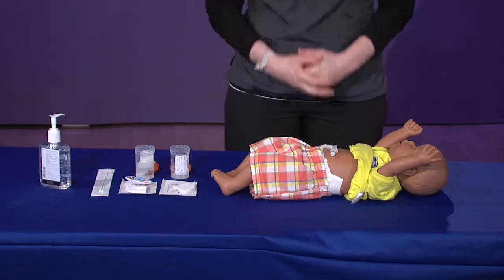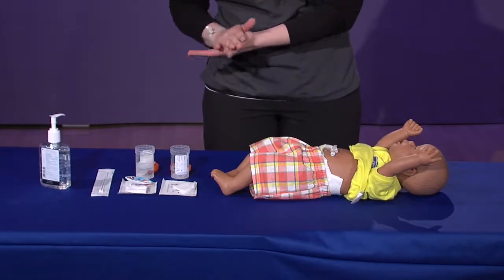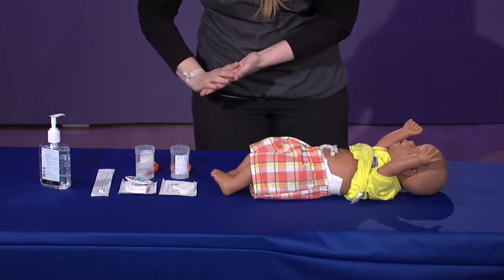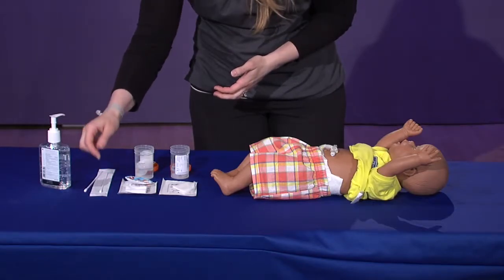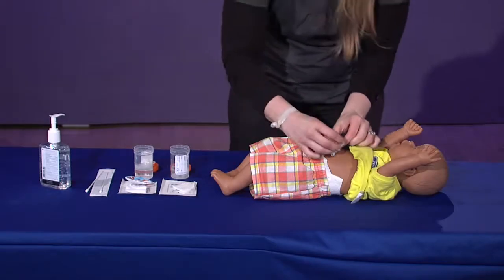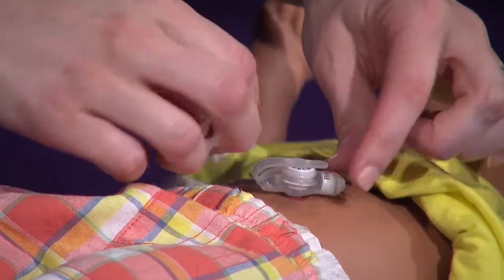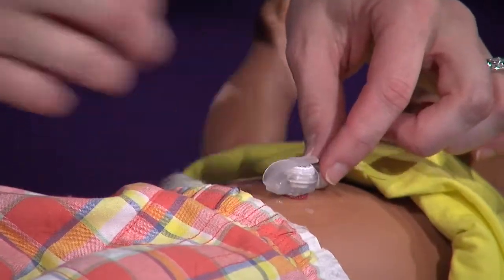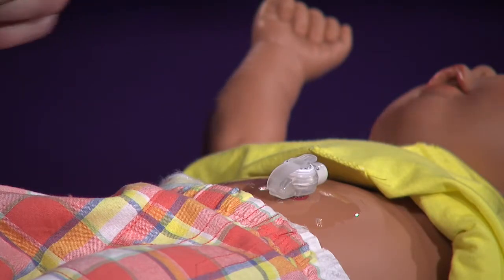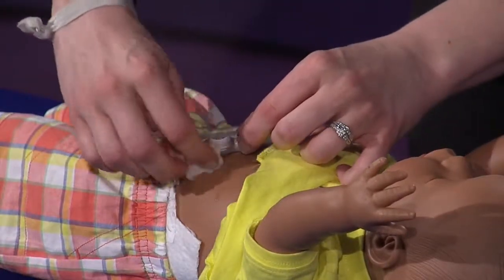Each day, you will clean your child's G-tube site. First, wash your hands with soap and water or hand sanitizer before touching the G-tube. You will use warm, soapy water on a Q-tip or gauze to clean around the G-tube site once a day. Rinse the area off with clean water after you clean it with the soapy water.